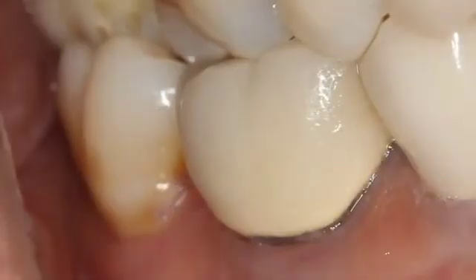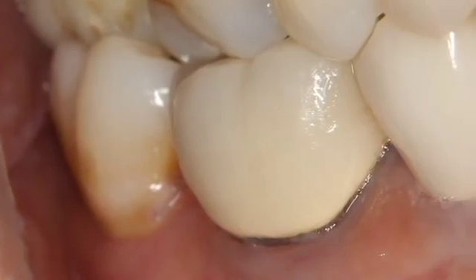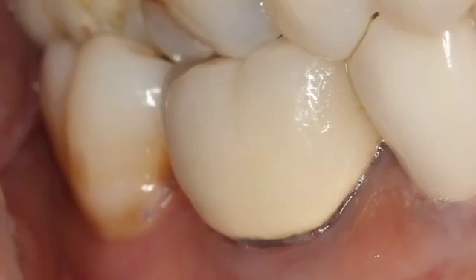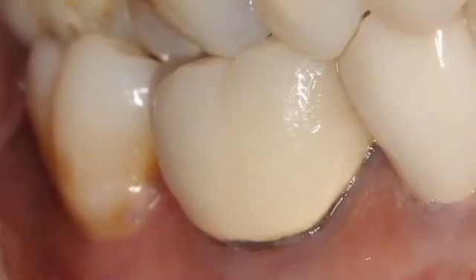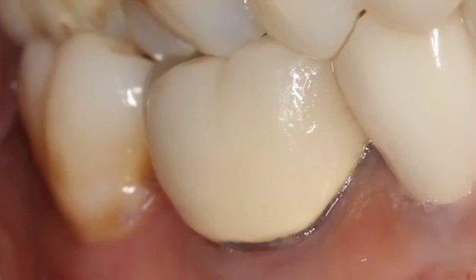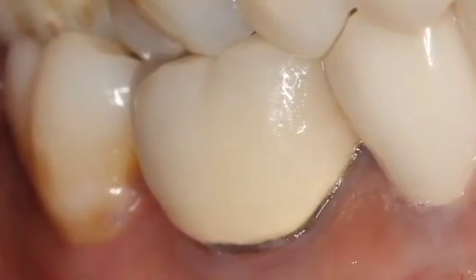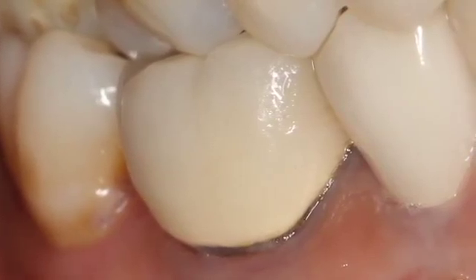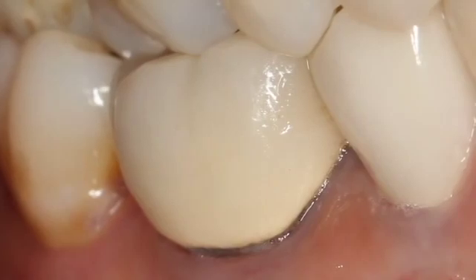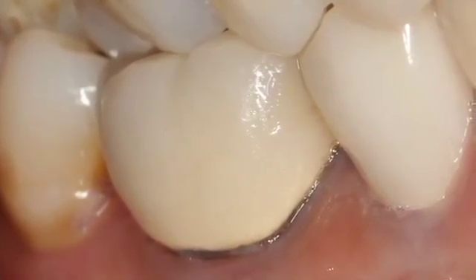We have a tooth that was deemed non-restorable, and we're going to remove this crown. Conventionally, to remove a crown, you would take some type of burr and section the porcelain and metal on the facial aspect onto the occlusal, onto the lingual, then take some type of instrument to separate the mesial and distal part of the crown and remove the tooth, thus destroying the crown — which is fine, though you go through a lot of burrs that way.